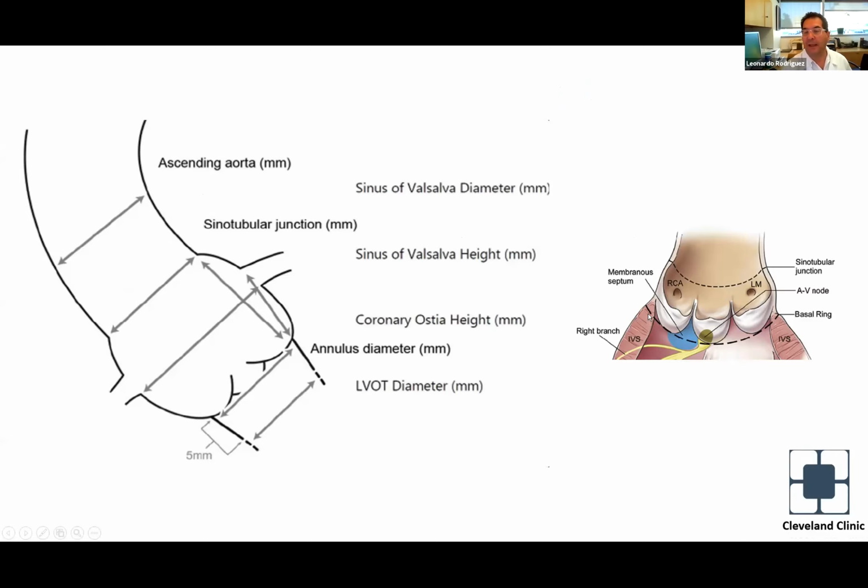Y luego, obviamente, la definición anatómica de las válvulas y de nuevo del anillo aórtico. También ven ustedes la relación entre las valvas aórticas y los ostios de las coronarias, y usted puede imaginar que si ustedes expanden la válvula y elevan estas valvas, pueden obstruir una de las coronarias, una complicación rara, pero conocida de este procedimiento.